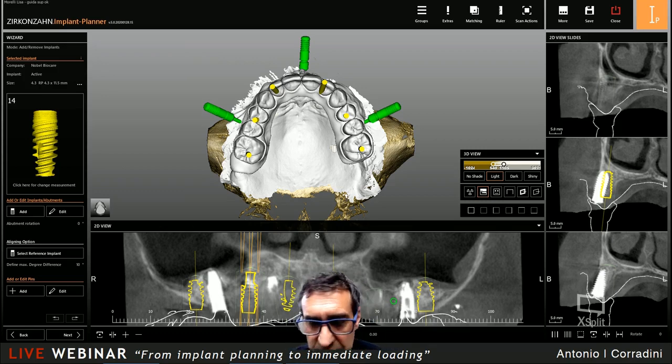But this is really nice when you have the possibility to analyze a setup related to a face scan first, and then analyze the placement of the implant. That's amazing for me. And if you are working really close to the doctor, you can discuss: can we do it in that way? Can we do it in another way? That's really important, and it makes the clinical team much closer to one another.